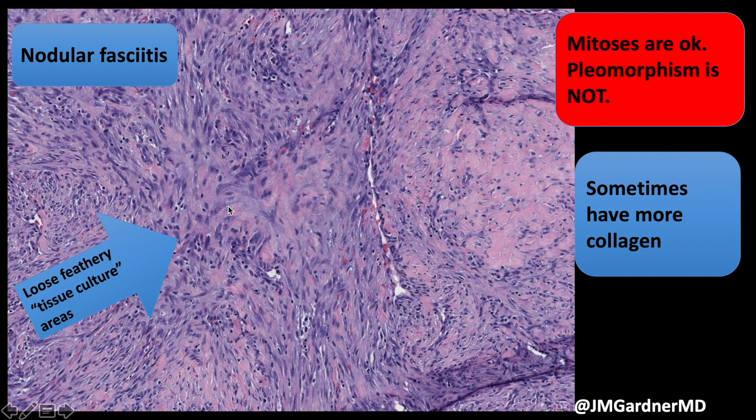Mitoses are often present and can sometimes be abundant, particularly in the more cellular early lesions of nodular fasciitis. However, you don't want to see hyperchromatic pleomorphic nuclei — that should really make you think twice about the diagnosis of nodular fasciitis.